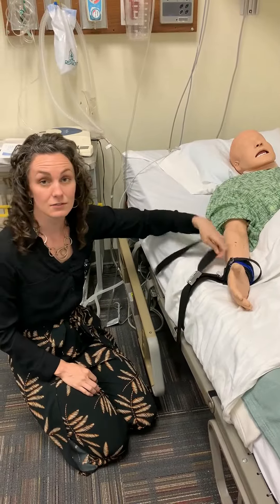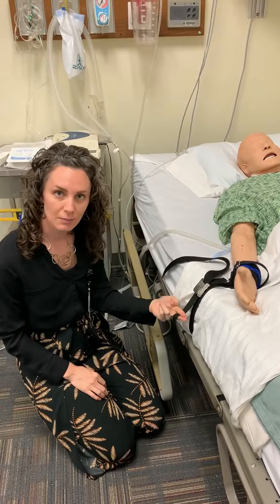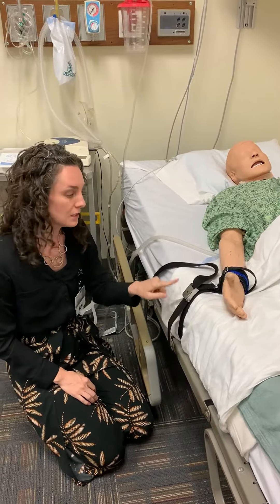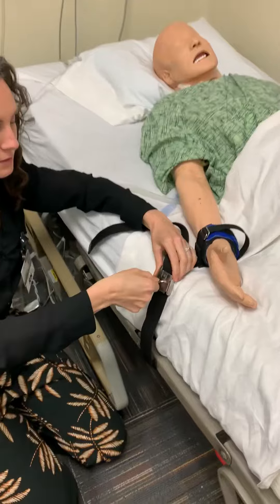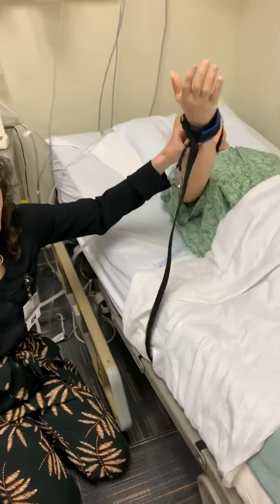There are a couple of ways to get this off in an emergency. Number one, you could just cut this strap right here if you have scissors available. Otherwise, if you have a key, you can unlock it here — just put it in, turn it, and then this will slide right out. Then you can do whatever you need to do with your patient.